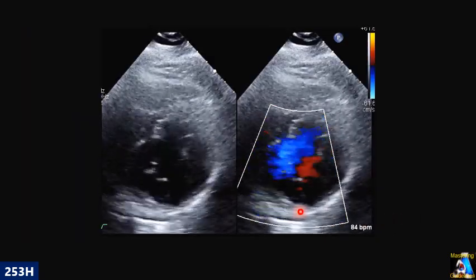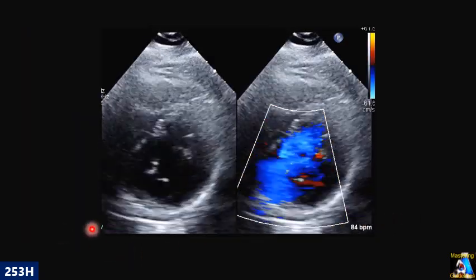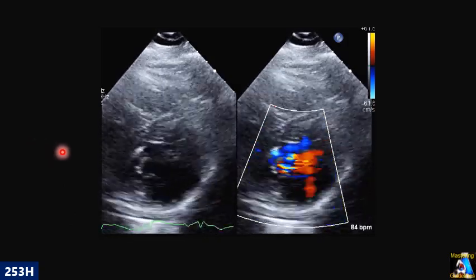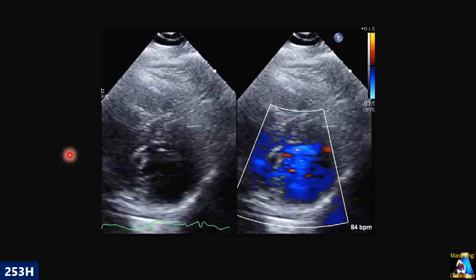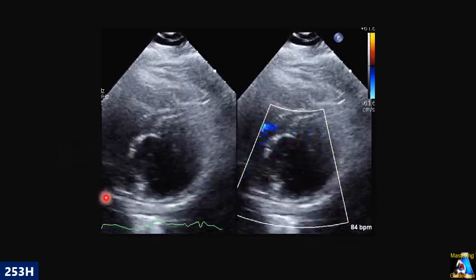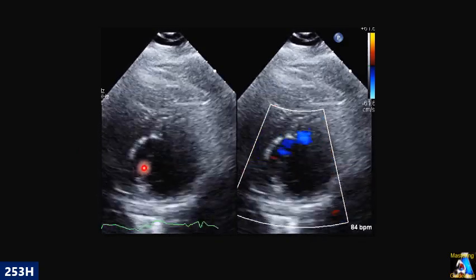You are scanning a patient and you get a PSAX almost between the mitral valve and tip of the papillary muscle, as you can see. Is that correct PSAX at that level or not? And if it's not, what maneuver do you have to do to fix it? And you know a correct PSAX should have what parameters and criteria?